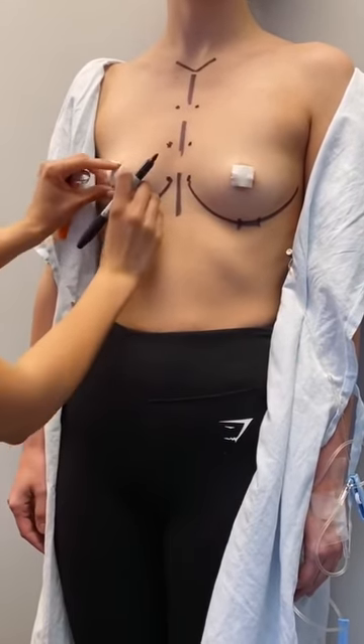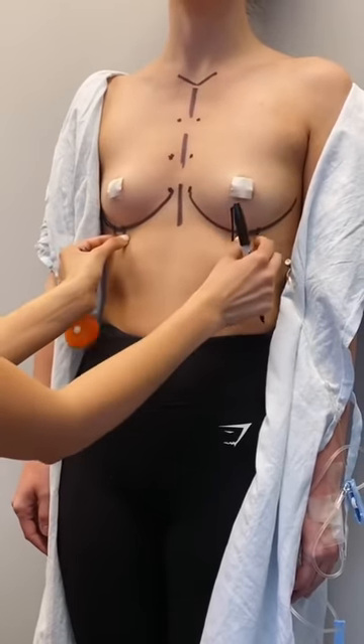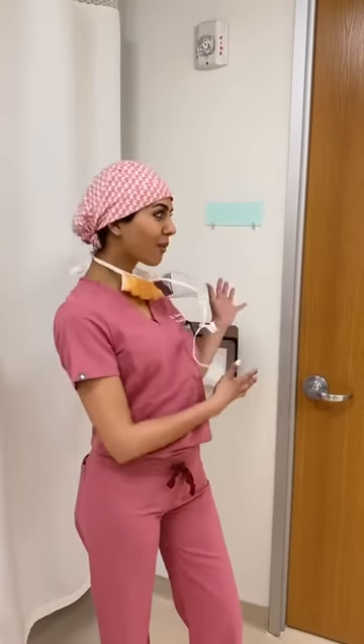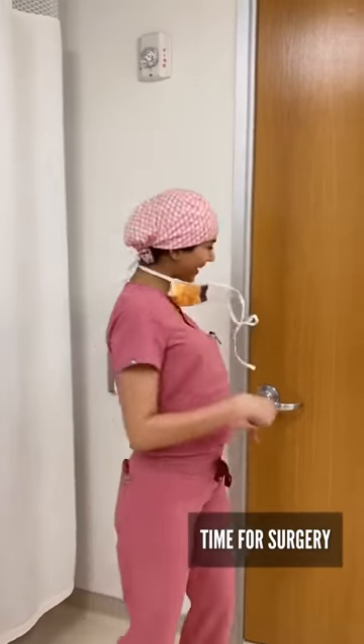You're going to see she fills all this volume right in here through these little incisions — that'll be her surgery. Here's the OR and we're about to go in and start our case. We'll film a little bit, so come on and check it out.